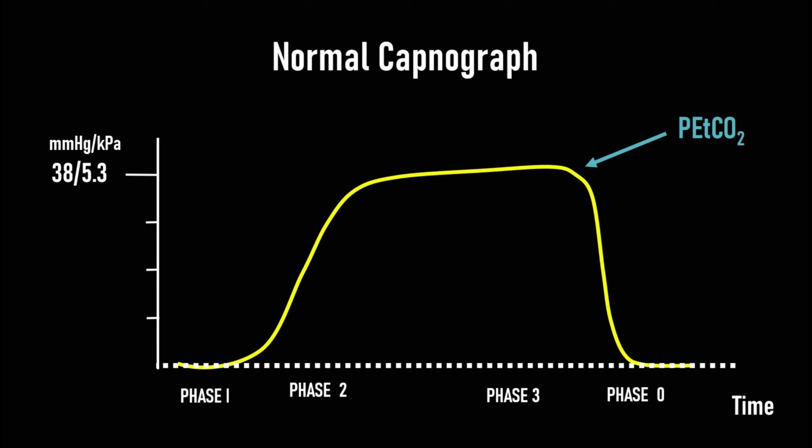So let's look at some examples vis-a-vis intubation where the capnograph is very helpful.